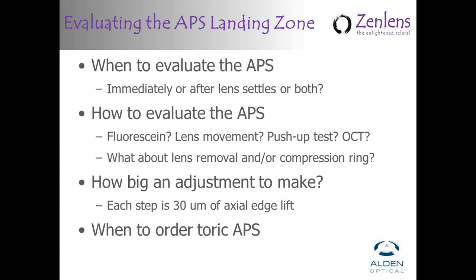I usually try to make the full assessment within a matter of 15 or 20 minutes completely, and then spend more time reevaluating more carefully at follow-up based upon how the patient's doing with the lens. And usually when they come back for follow-up, I want the lenses in for several hours before their return visit.